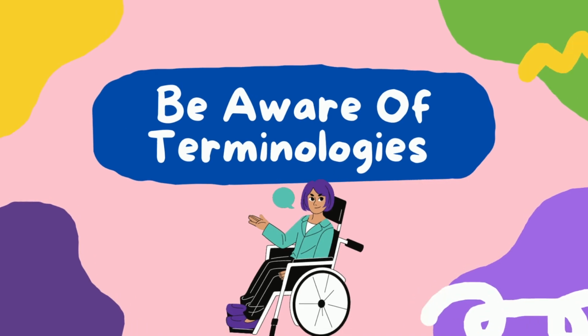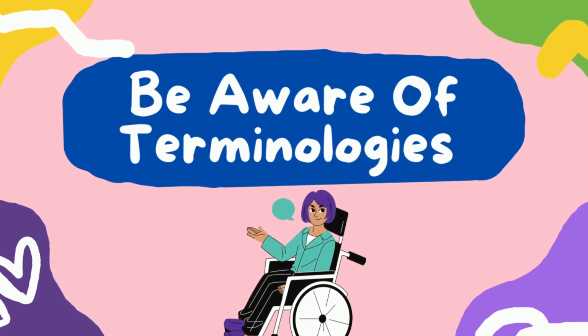Be aware of the terminologies and the questions that they're gonna ask you. So you might have heard the word ergo when we're referring to the seat and the angle of the seat. It's a word I hadn't really heard before.